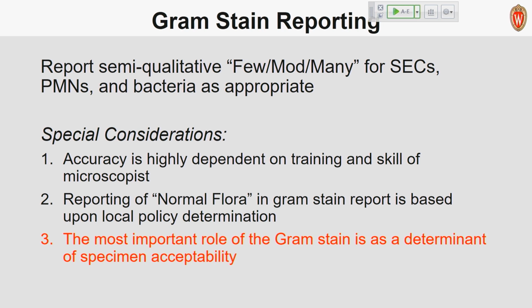Reporting a normoflora in a Gram stain. There is not a lot of guidance, again, from Clin Micro on this, so it's really going to be based upon local policy determination.